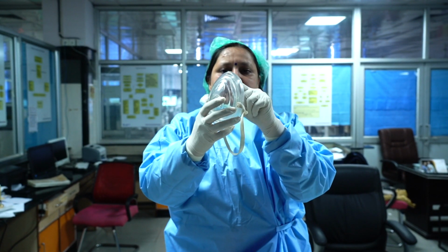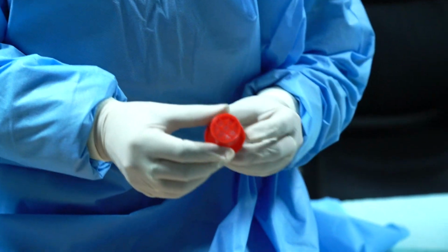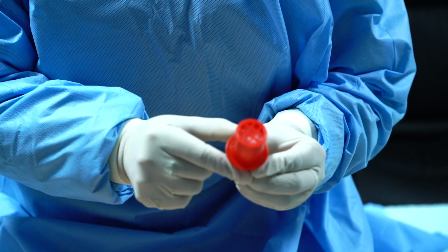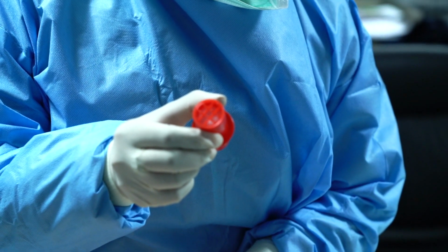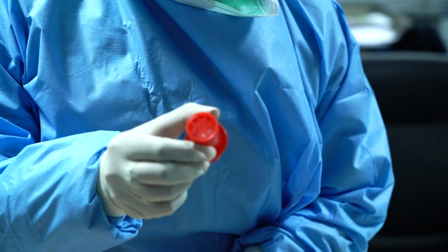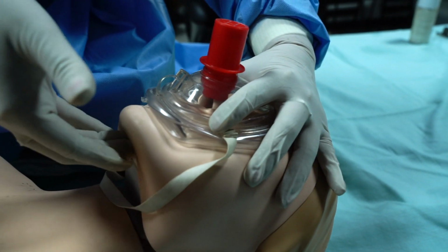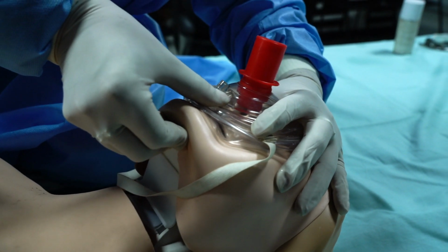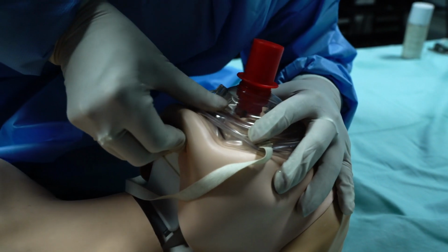Then the pointed surface should be over the pointed finger. This surface should be on the face for the ventilation, so that whatever secretion or bloody material is present inside the mouth of the pregnant lady will not revert back over the thumb and pointing finger. Like this, 3 fingers below the chin and the thumb over the mask. Give 2 breaths, each breath of 1 second, with visible chest rise.